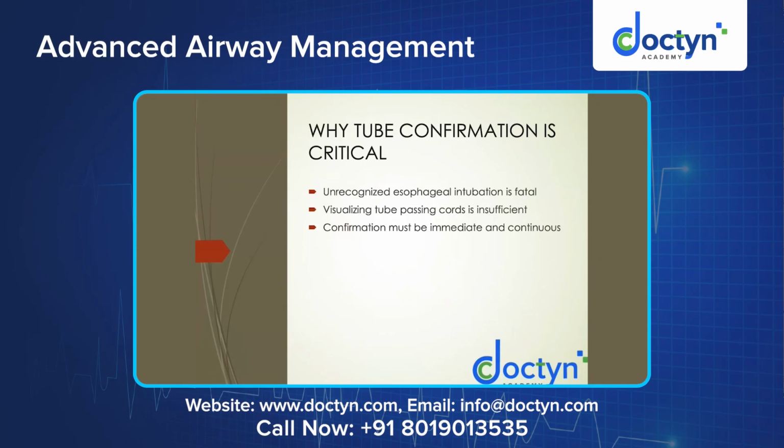So how do you confirm whether the tube is inserted in the trachea or in the esophagus? Unrecognized esophageal intubation can even be fatal, because if the tube is in the esophagus and you continue ventilation, the air is not going into the lungs, the oxygenation will not improve, and there will be further desaturation. So you have to always immediately identify whether wrong placement of the tube has happened. Just visualizing the tube under vision is insufficient. So confirmation should be done immediately.